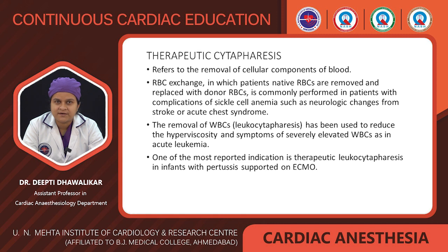Now coming to just a word on therapeutic cytapheresis and hemadsorption. Therapeutic cytapheresis refers to removal of cellular components of blood. RBC exchange, in which patients' native RBCs are removed and replaced with donor RBCs, is commonly performed in patients with complications of sickle cell anemia such as neurologic changes from stroke or acute chest syndrome.